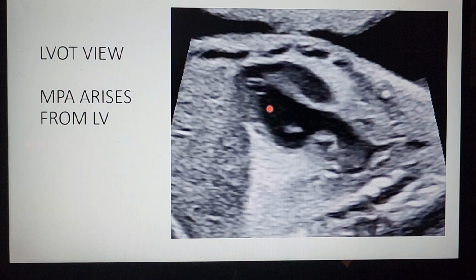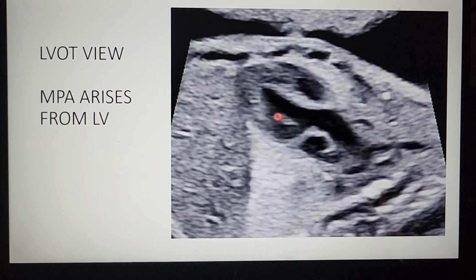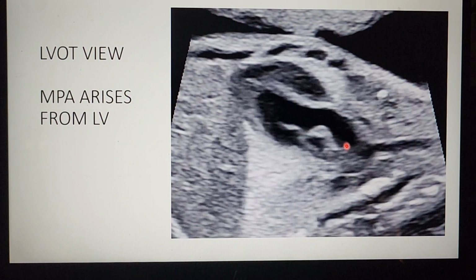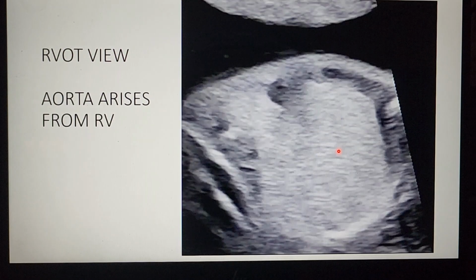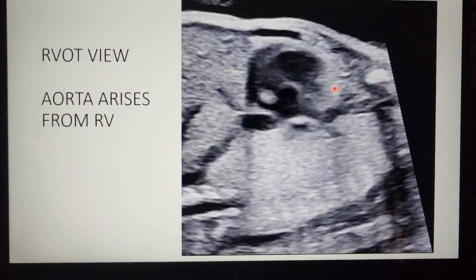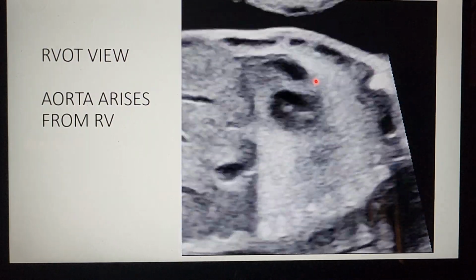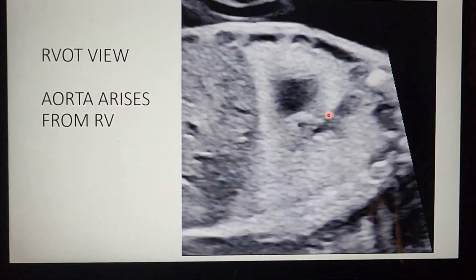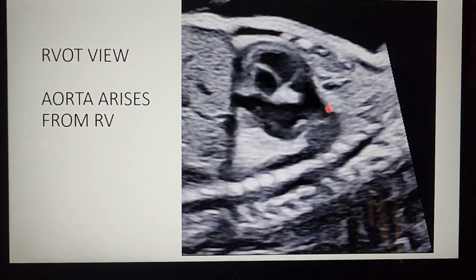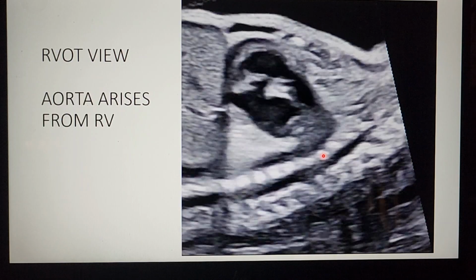Again another video showing beautifully the LVOT getting disfigured with the vessel pointing posteriorly and branching. So this resembles a baby bird beak appearance. And now we have the RVOT showing the step down disfigured outlet, which is the aorta without branch and going to form the descending aorta.